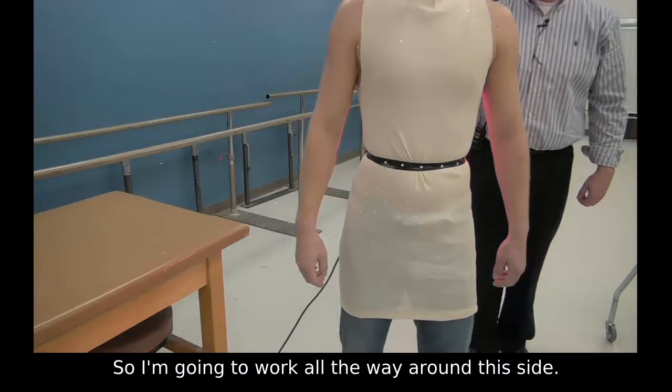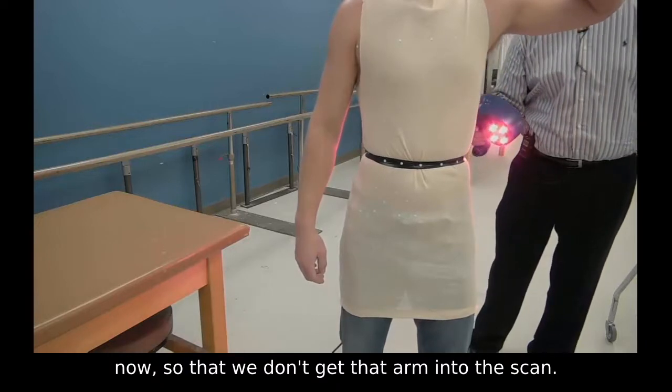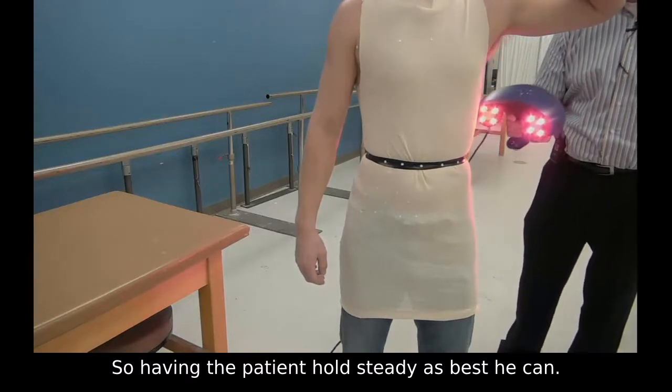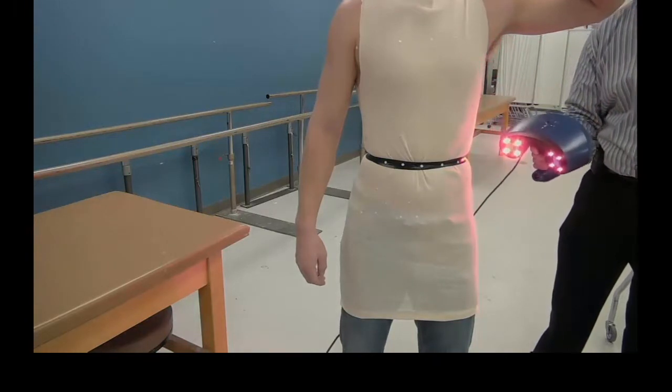So I'm going to work all the way around this side. I'll have you lift your left arm for me now, just so that we don't get that arm into the scan. Just having the patient hold steady as best he can. This should allow me to get pretty much all the way around the patient.